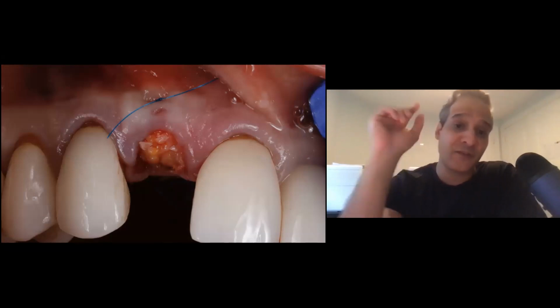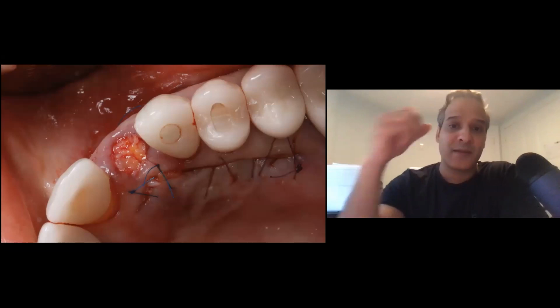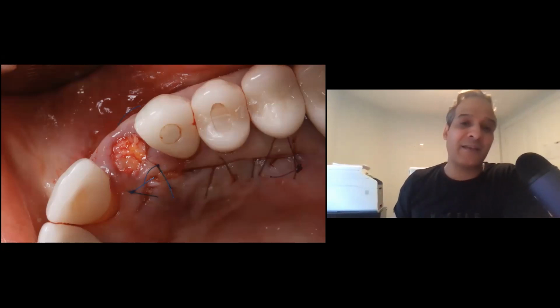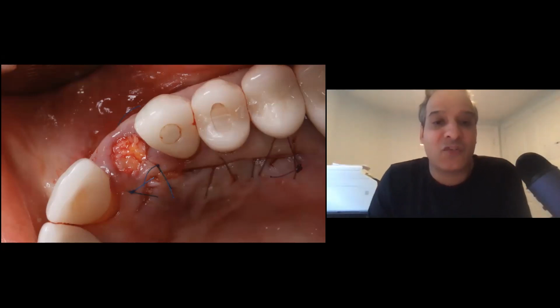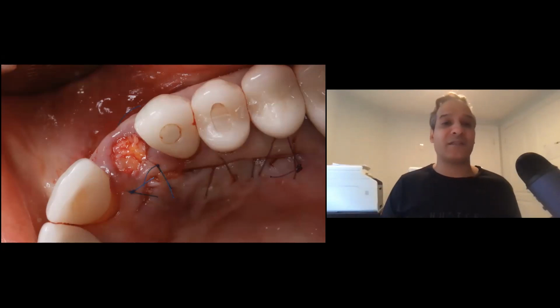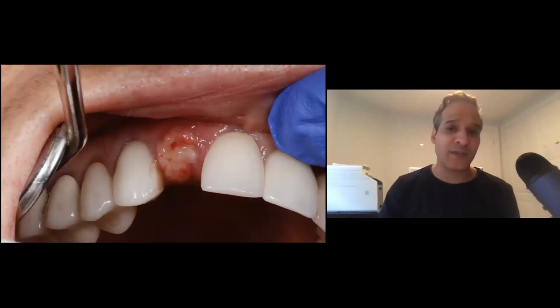and then it's held in place with the suture. So this is our connective tissue graft going from the palate through that small incision. I sort of tunnel it underneath that little bridge of palatal tissue on the back of the sulcus. It slides over the socket, tucks into the buccal, and seals the site. And this way, it keeps our bone graft.